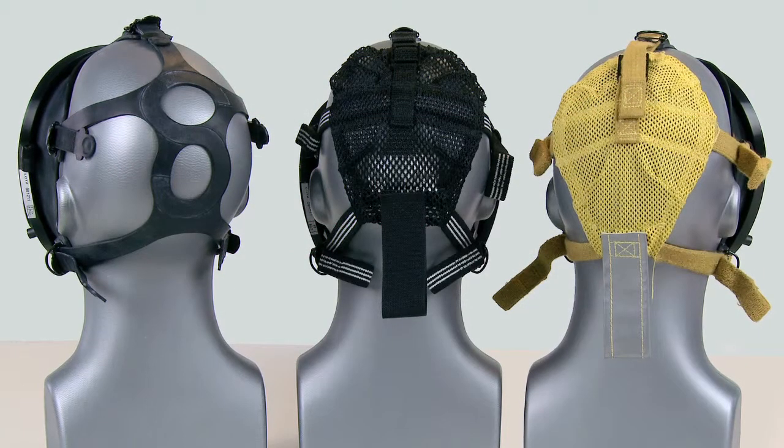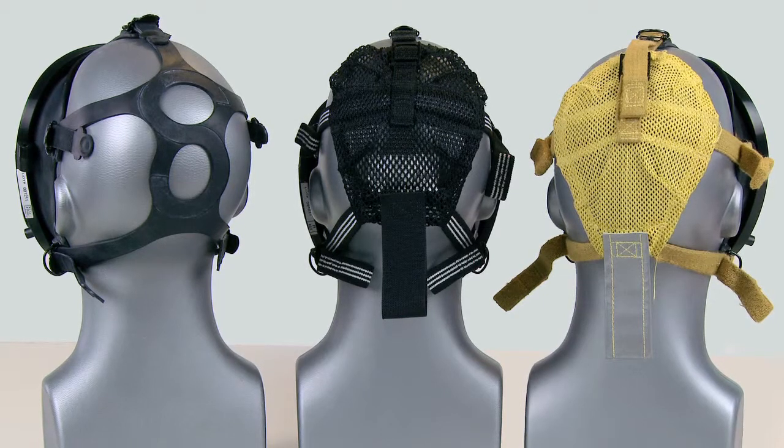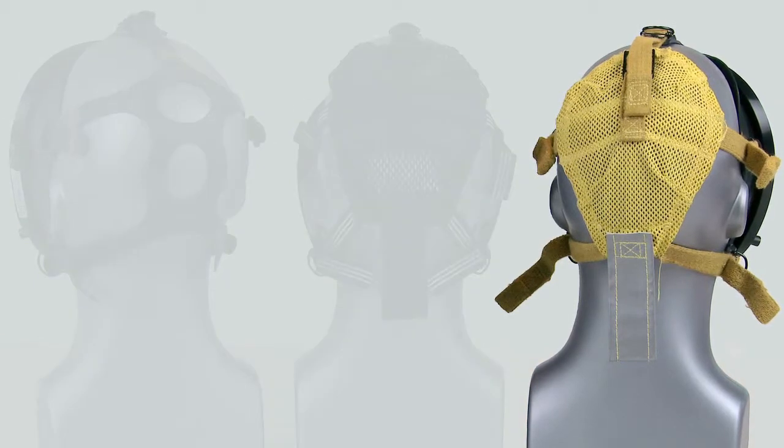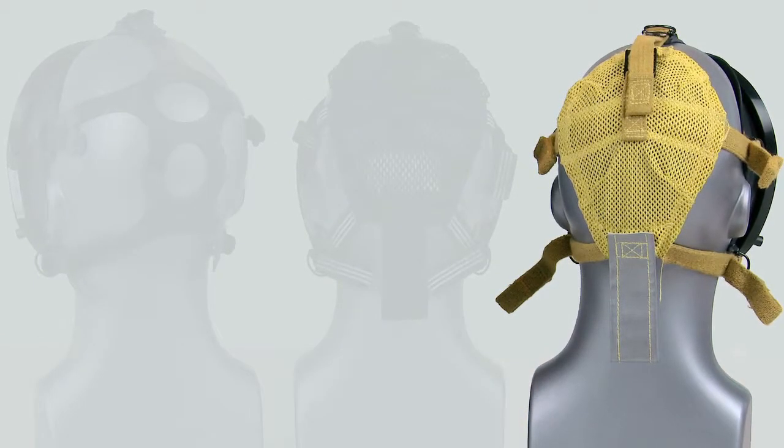The donning procedure is the same for Kevlar, polyester, and rubber head harness versions of the AV3000 facepiece with Sure Seal. Here we will show donning using the Kevlar head harness.